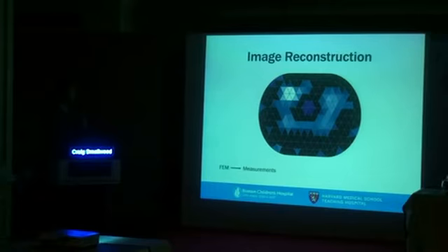But we have these measurements. So you can see as these little triangles get wider, that's the increased impedance. So we can see here that we have a decent amount of lung distribution here, and we'll see the largest increase in here, and these are actual patient measurements. And oh, by the way, we're looking at this image the exact same as an MRI or CT. So this is the left, this is the right. And then the feet of the subject would be out here and the head would be behind the screen. That's to orient you to the way the image looks.